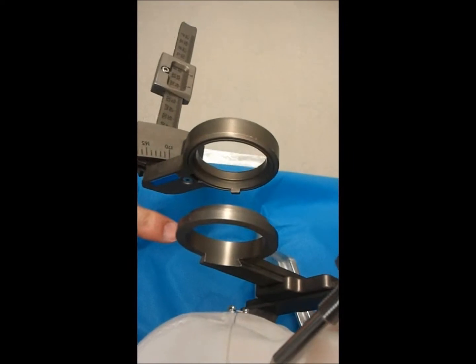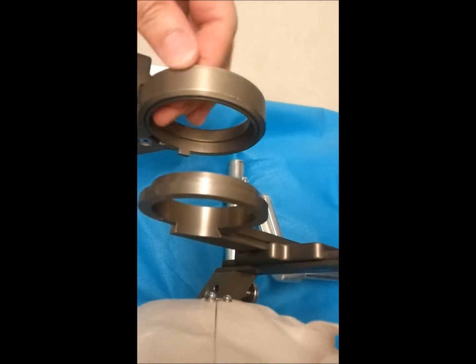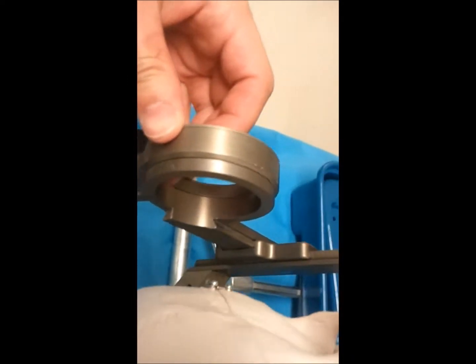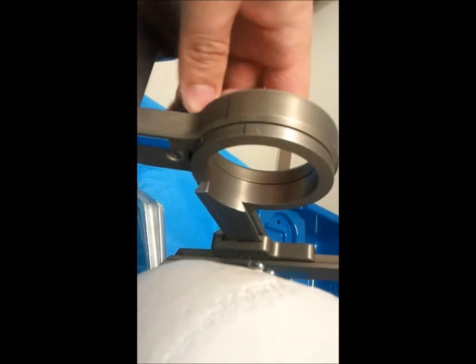And you can see there's a notch here that's a little difficult to see, but what we'll need to do is loosen this so that the ring will move. And then spin this around so that the notches are lined up to the tabs there. Once that's lined up, you can lock this in if you're by yourself, and that'll help hold it.